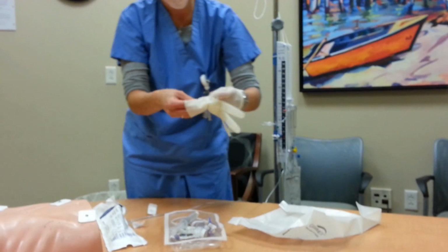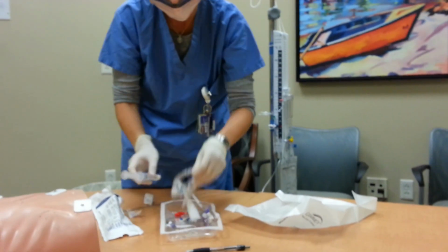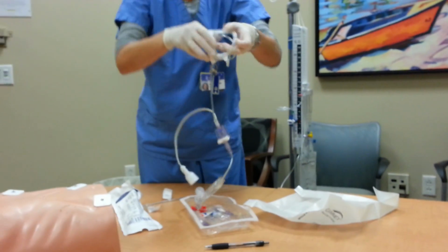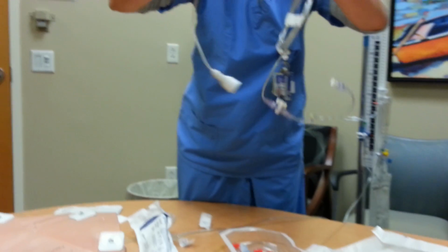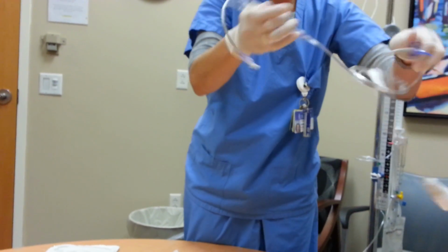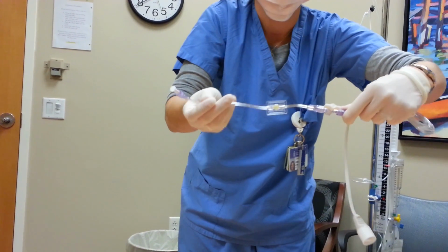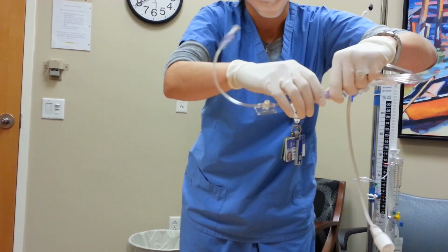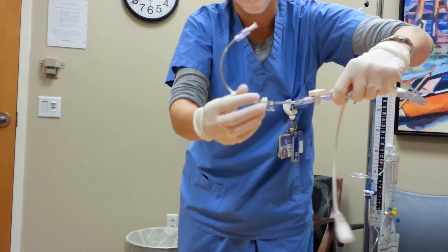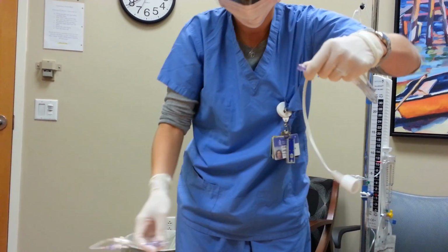And since you're not priming with a bag of saline, and you're priming with a saline syringe, the first thing you're going to do is take off the spike and just get rid of that. Also, there's one other piece you're going to take off because you don't need it. This piece, of course, is designed so that we can draw blood off an arterial line or CVP. But we want to remove it because we don't want anyone to confuse it for a place to draw off of or a place to infuse anything through. So you just get rid of it.